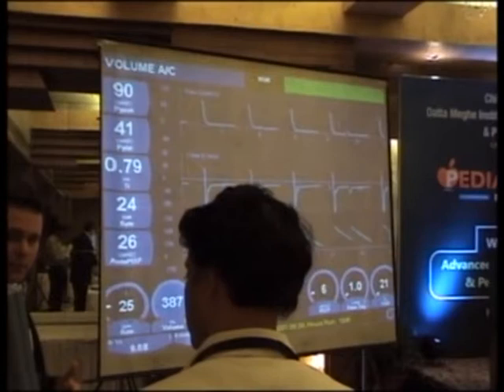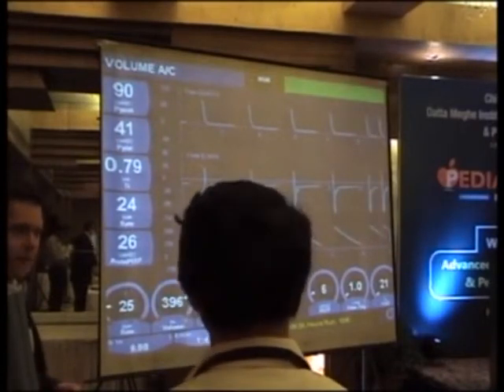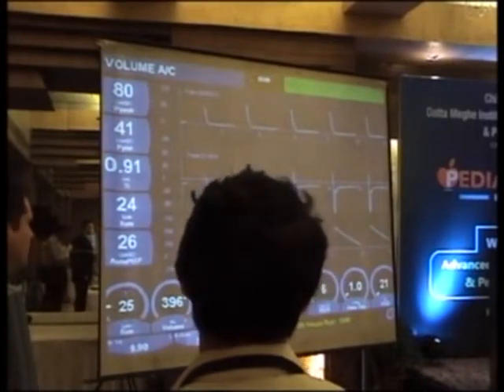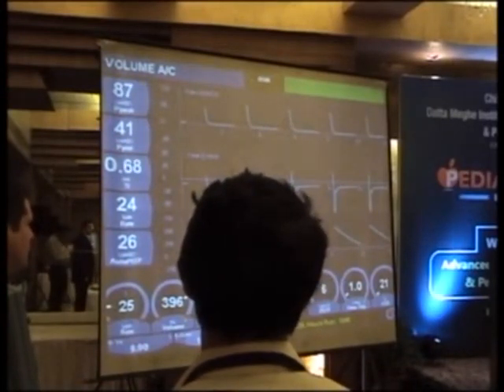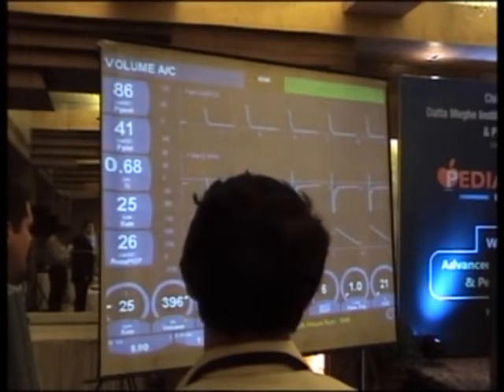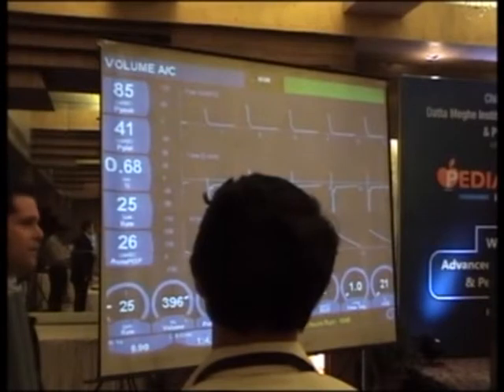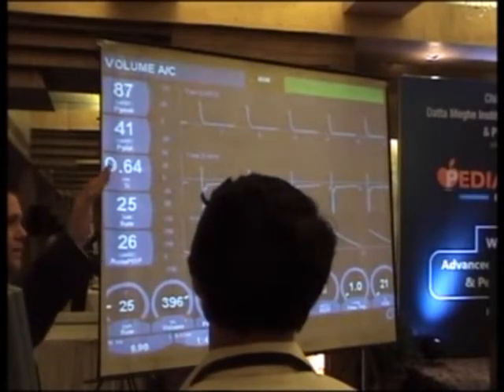You were weaning that, weren't you? All right, there you go. Let's give him a few breaths. Let's give him 5 or 6 breaths or a little bit more. Yeah, we're still gas trapping quite a bit. Let's go up on my flow just a little bit more. Is that okay? Yeah, because higher flows are going to be higher peak inflation pressures, but at zero flow.